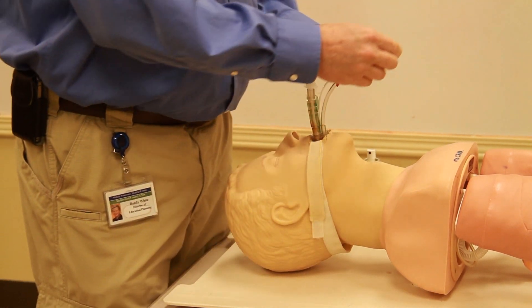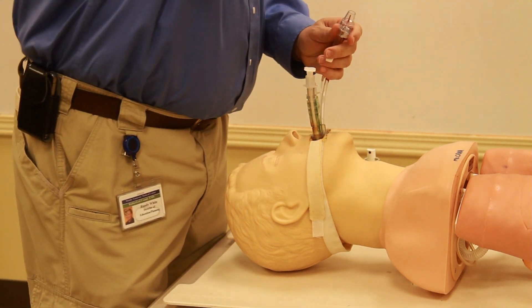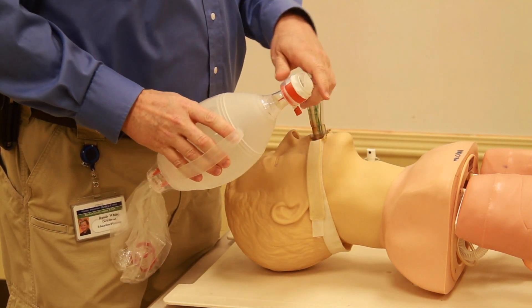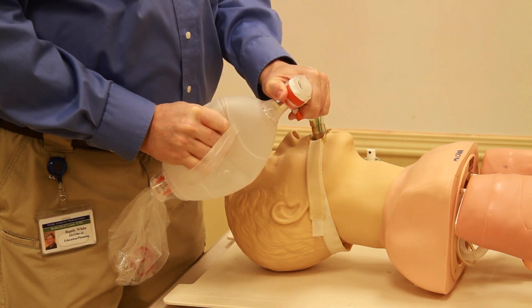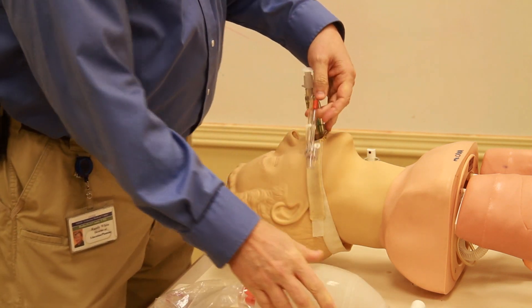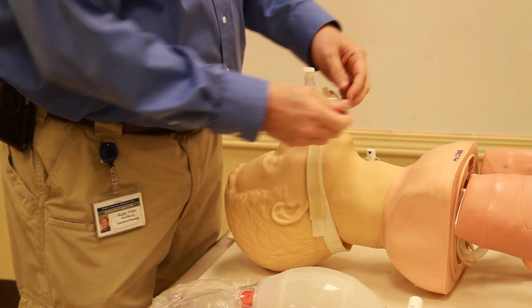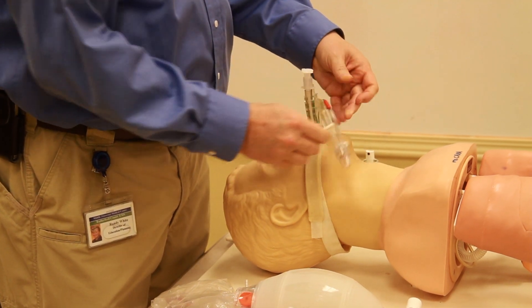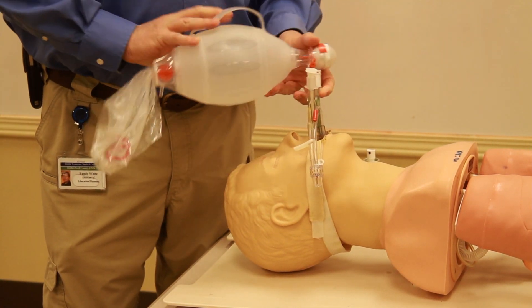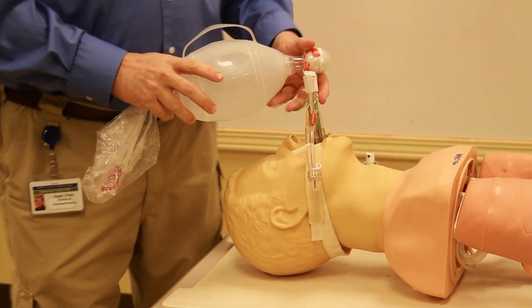For this airway, you're supposed to inflate it by mouth, but I'll use a bag valve mask device since this airway has been used several times before. I inflate all the balloons, making sure the stopcock is secure on one port and this one is loose.